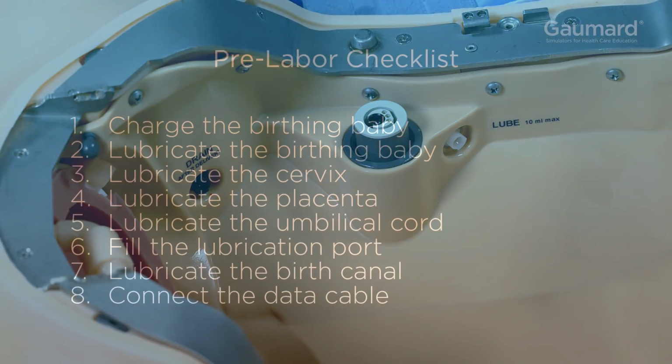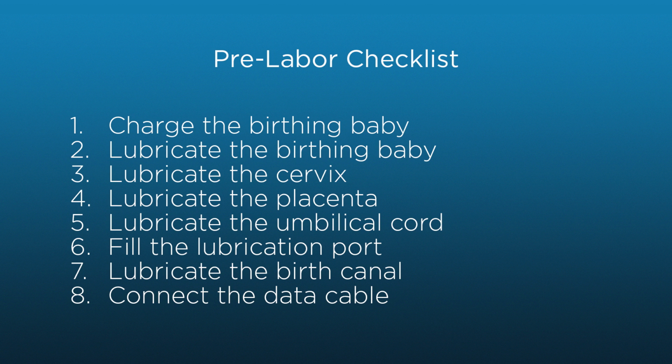Victoria is now ready to prepare for another birth. Be sure to complete the pre-birth checklists while setting up for another delivery.